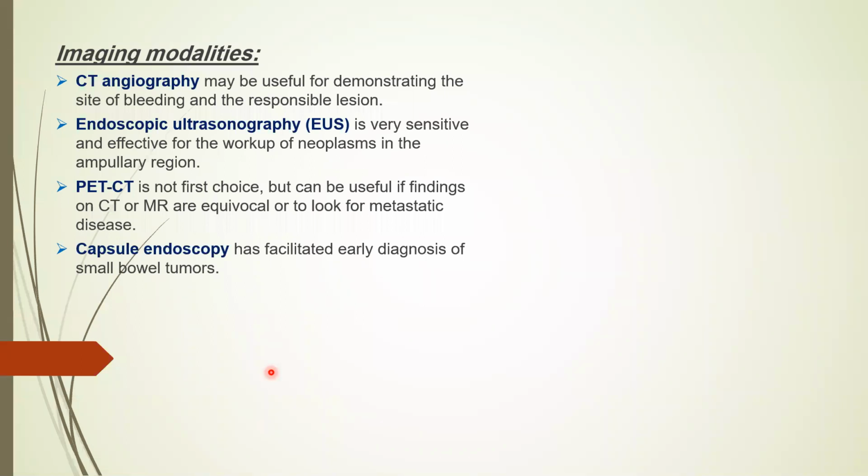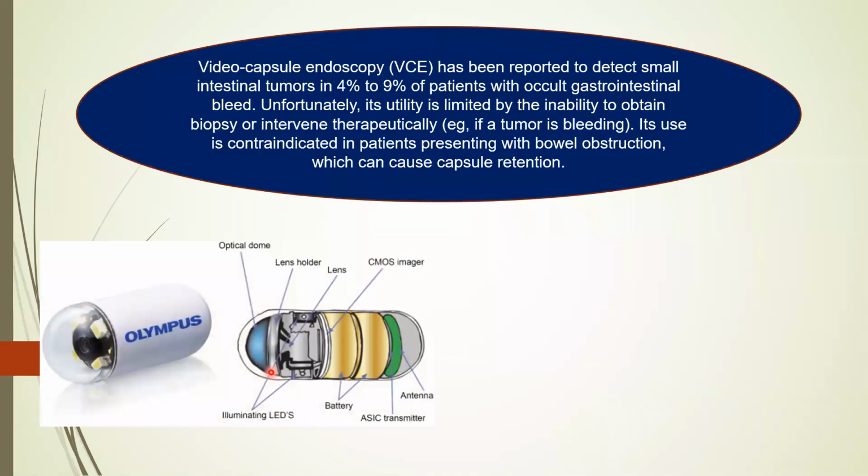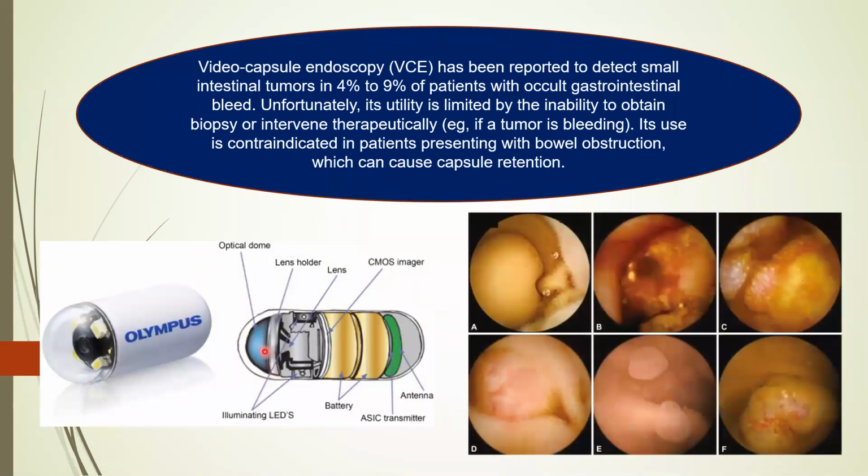We also have the capsule endoscopy, which also may play a role in the workup of small bowel tumors. This is video capsule endoscopy. Its main limitation is the inability to make intervention and inability to take biopsy.